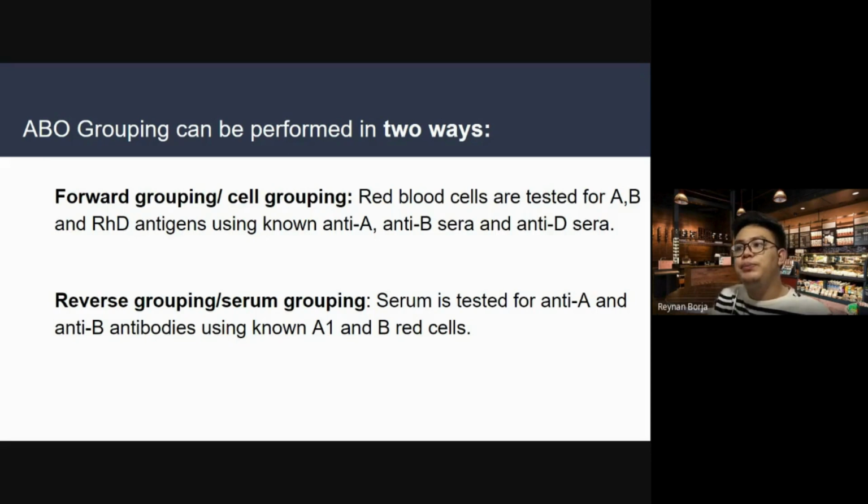Other term. Before ko sabihin, tandaan nyo, siyempre, kabaliktaran na nun. Kabaliktaran nung sinabi ko earlier. So, your indirect typing and your backward or back type. Okay? So, dapat familiar ka sa mga other term kasi baka pag lumabas sa board exam, ginamit through your back grouping or back typing, serum is true or false. So, ano yung back typing? So, di ka familiar. So, kahit familiar nyo lang yung mga other term.